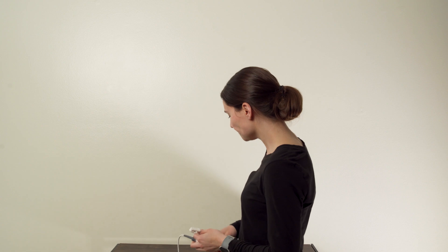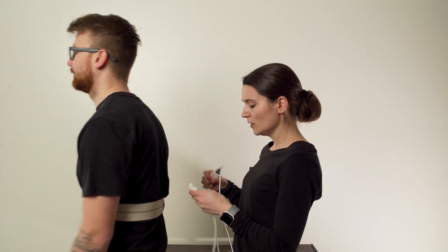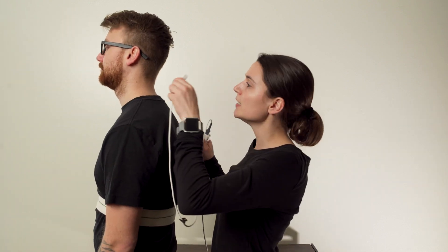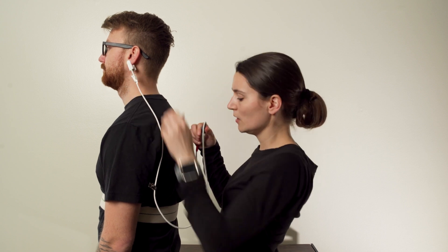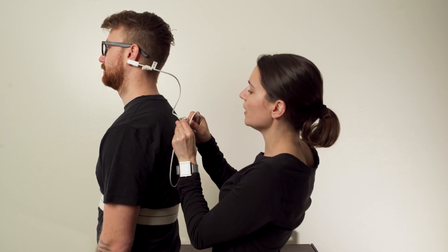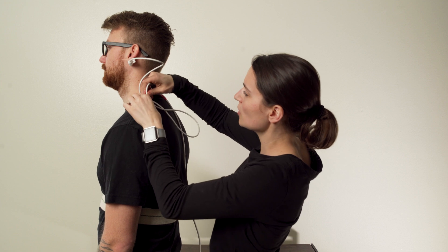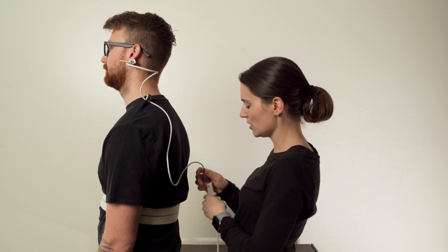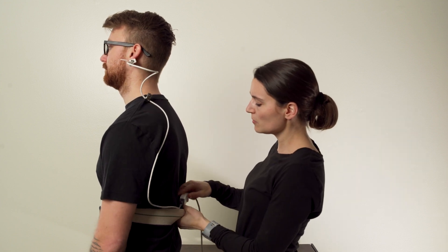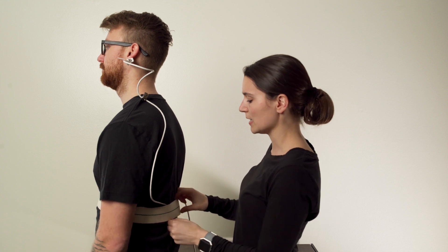Next, I'll show you how to attach this to the patient. First, you'll bring the sensor and attach it to the patient's earlobe. I recommend using a clip to attach the cord directly to the patient's shirt. I often put this middle piece right in the gate belt to avoid excessive pulling.